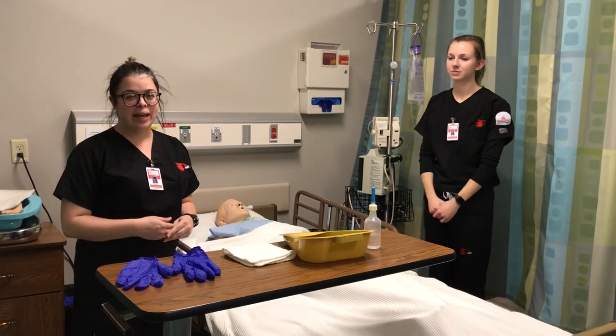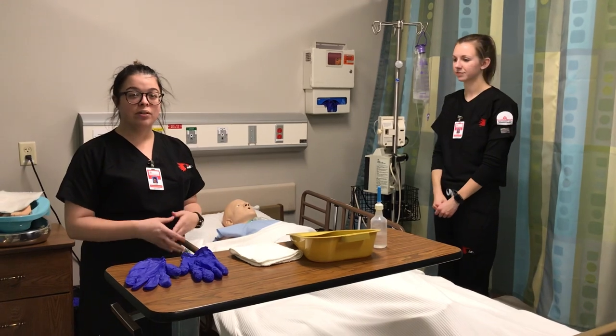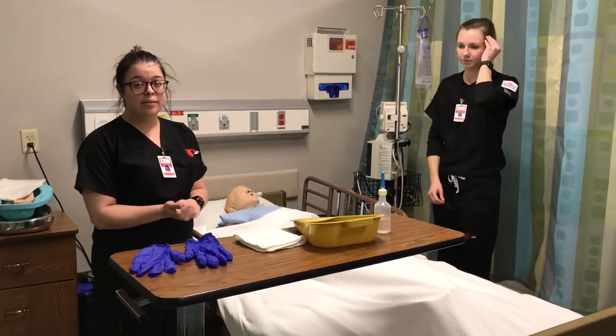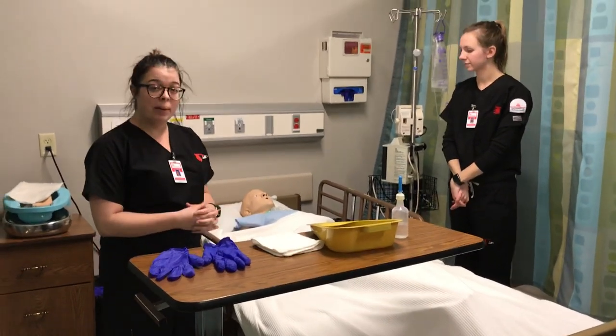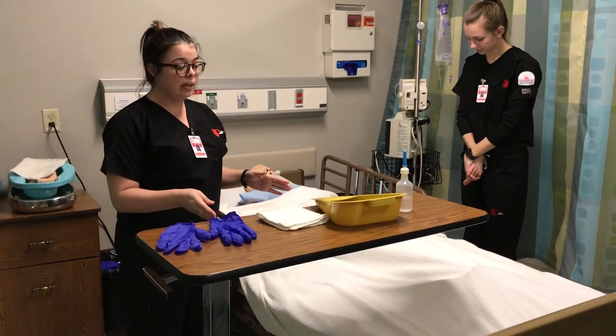Hi, my name is Jordan and this is my enema video. The first thing I would do is come in, introduce myself to the patient, wash my hands, ask for two forms of identity from the patient, and explain the procedure to them and what is about to happen.